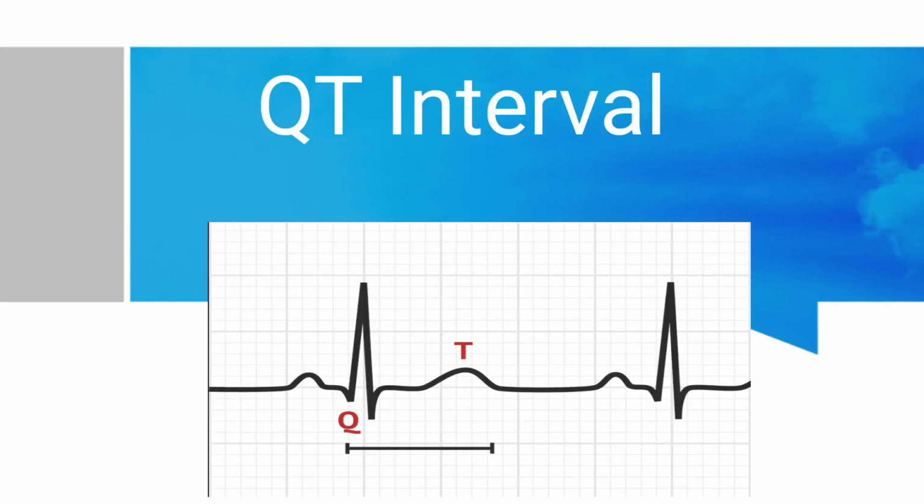Friends, in this series of ECG basics, today I will talk about QT interval.